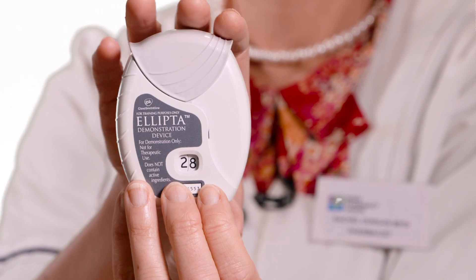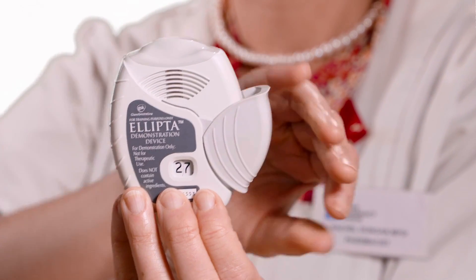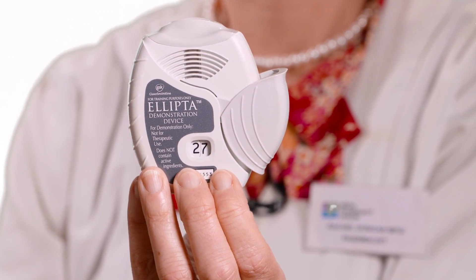Do not shake the inhaler. Hold it steady. Slide the cover down until it clicks. The counter will go down by one to confirm. If the cover is opened and closed without inhaling the medicine, the dose will be lost.